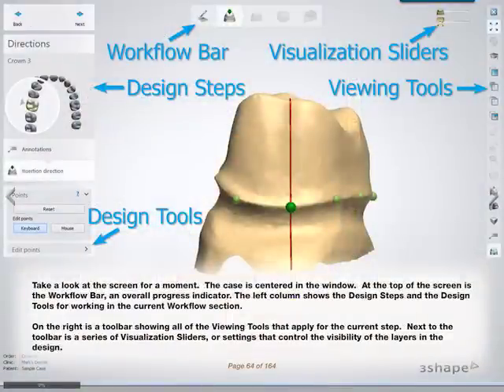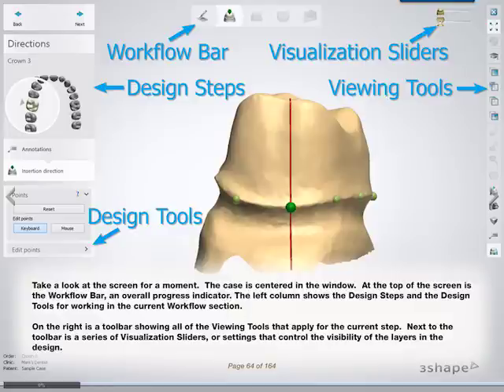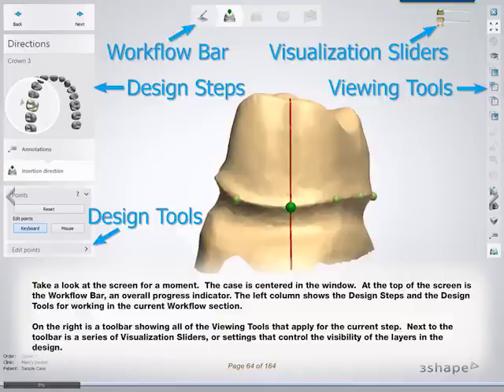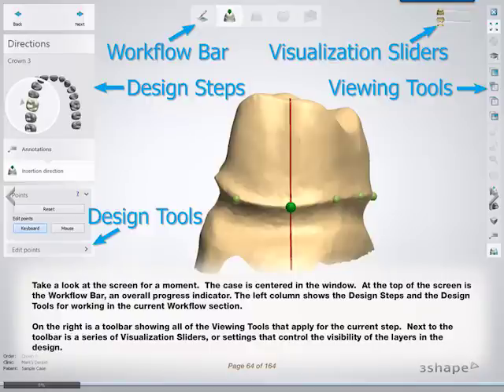Take a look at the screen for a moment. The case is centered in the window. At the top of the screen is the workflow bar, an overall progress indicator. The left column shows the design steps and the design tools for working in the current workflow section. On the right is a toolbar showing all of the viewing tools that apply for the current step. Next to the toolbar is a series of visualization sliders or settings that control the visibility of the layers in the design.